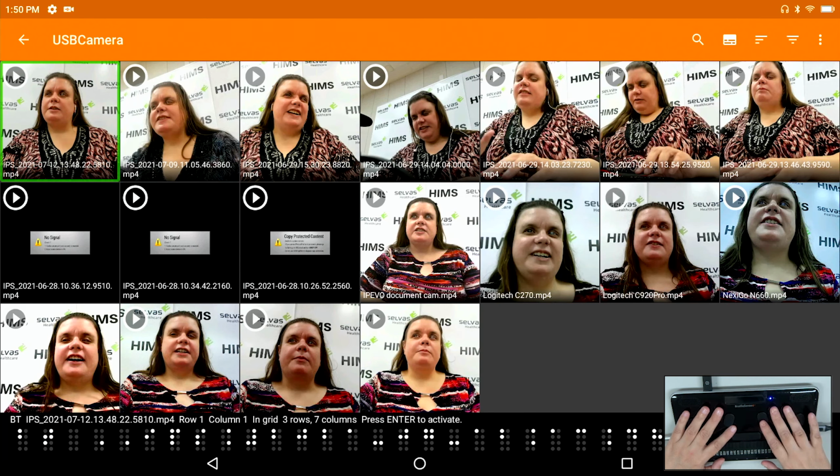Now, because this does give more true-to-life camera quality, we used this to make the samples that we're going to show you next. We tested several webcams with the BrailleSense 6 just to see what all would work and sort of identify the quality and ease of use and things that we wanted to recommend to you. So now we're actually going to show you several samples that we did shoot using this particular application.